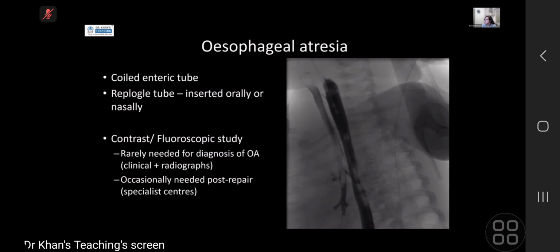No, I think in my trust we don't do tube esophagrams, so we just do a routine swallow, because the surgeon says that unless it's a very big defect, then they will be worried. Yeah, and the reason for the tube esophagram is that you want to give enough pressure, because some small tracts can be opacified with a normal swallow only if the pressure is high enough. So which is why you want direct injection of pressure. Yeah. So I think we do them in the recurrent aspirations, chest infections, the ones where we're looking for a really small tract. We'll do a tube esophagram, as Sam has suggested.